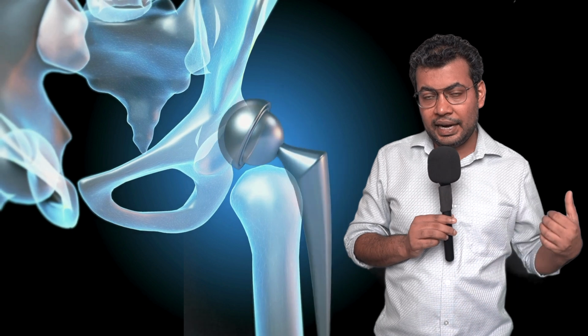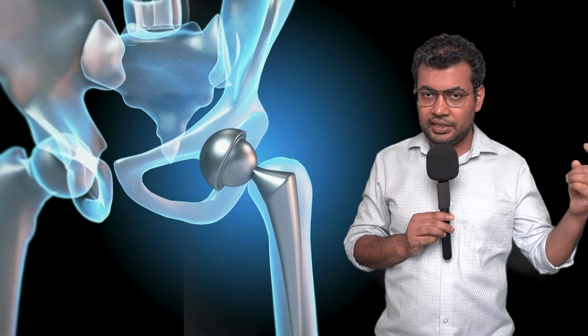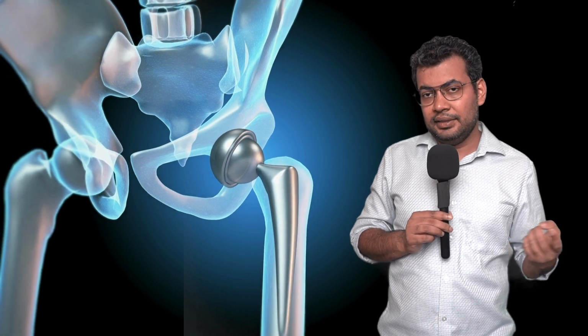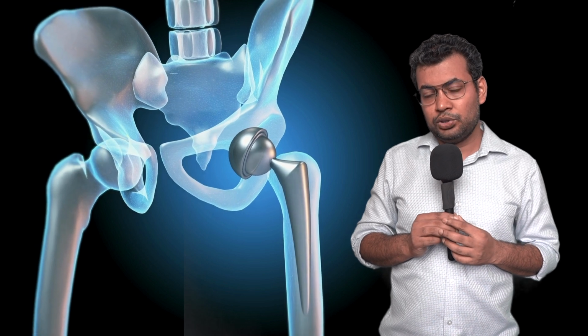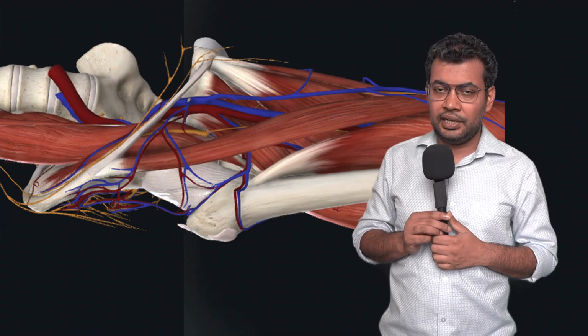So then we cut the capsule, we dislocate the femur, and so now we have both the ends free, proximal and distal. We have cut the circumferential capsule and lower down we have taken the osteotomy. So now we can make the adductors taut, and gradually we will cut all the adductor muscles.